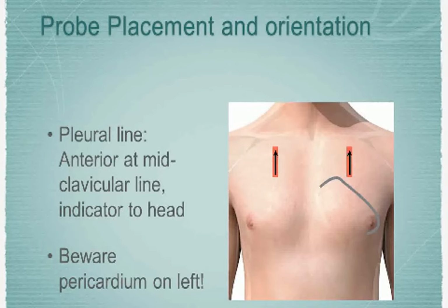When people are supine on the bed and they're round, the most anterior part of the chest where a small 10% pneumothorax is going to go is not always at the apices. In fact, it's not usually at the apices. So if they're laying flat and their apices are actually lower than their anterior chest, you'll miss it. And I've had residents that miss pneumothoraces. So put your probe there and then just slide down a couple of interspaces until you're sure that the whole lung is exposed. And we're talking about trauma patients who are laying flat on a gurney, so you can't rely on your chest X-ray. This is your go-to device.